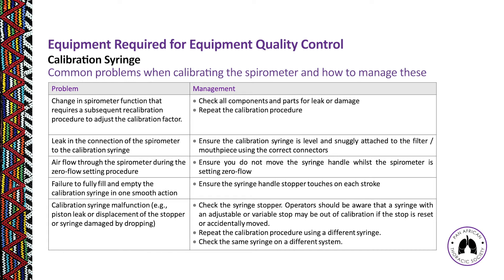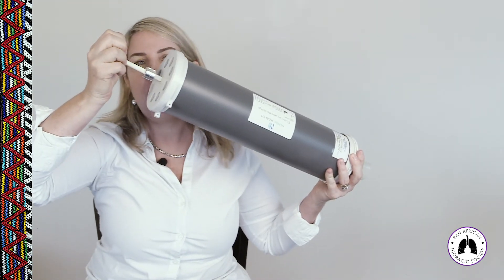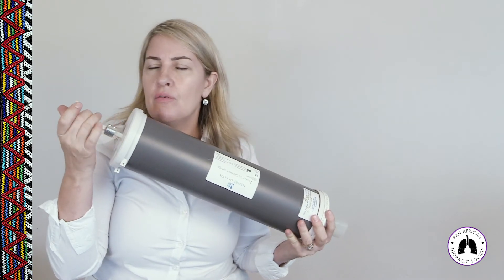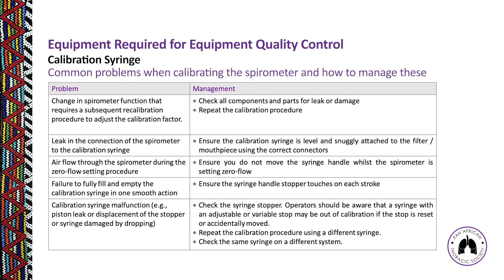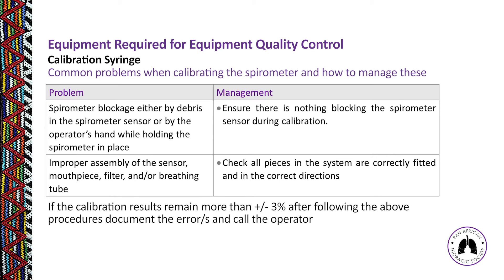Another common error is not pulling the syringe plunger all the way out or not pushing it all the way in, leaving a gap that results in incorrect volume measurement. Make sure to push the handle fully in and out. Also, a calibration syringe can malfunction due to a leaking piston, displaced stopper, or damage from being dropped — if dropped, recheck calibration before using it on a patient.